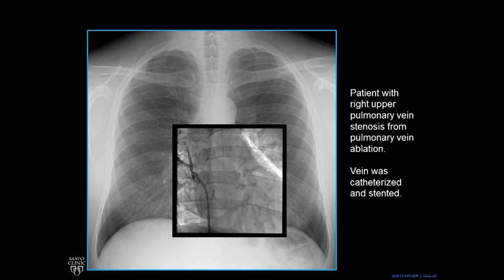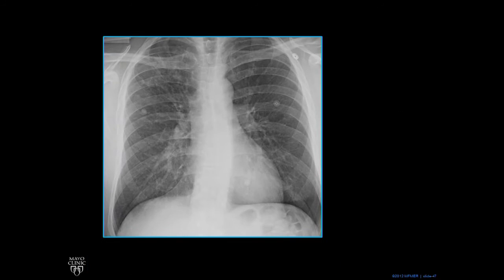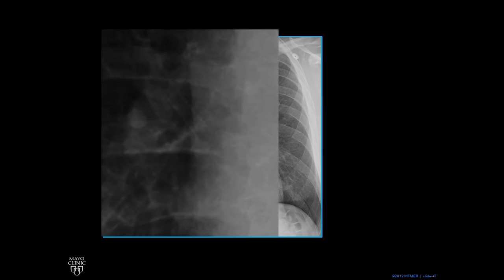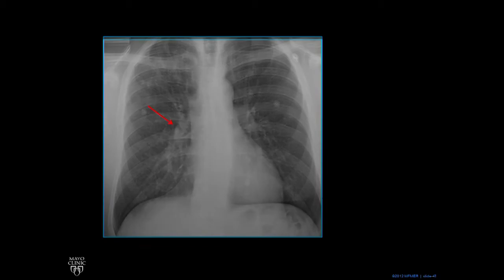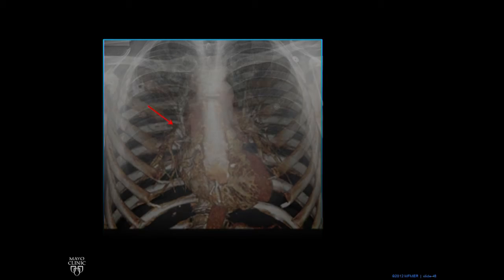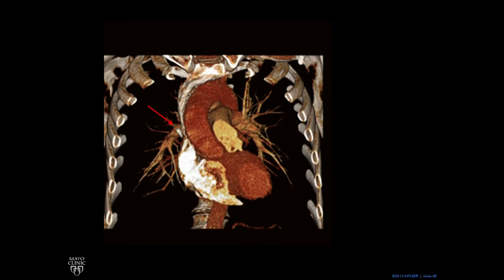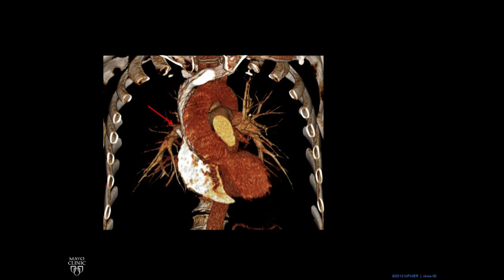This vein was catheterized and stented, meaning a metal tube was put in to keep it open. Can you see the stent? There it is — it's this metal tube keeping that vein open. Keep your eye on that stent, fade away, overlay the CT scan, peel back, and there's the stent. The point of this is to show that the pulmonary veins really do run in that area. The right upper pulmonary vein is stented — you can see it as a white structure.